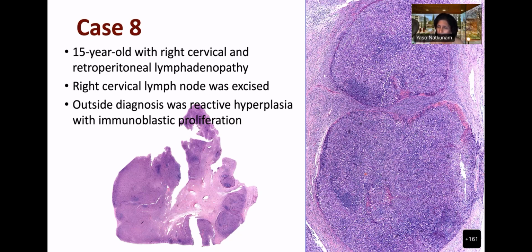It seems to me to have a mixed architecture, with one part of the lymph node showing complete effacement of the architecture on the left half, and the other half showing a follicular nodular pattern, with the two nodules, follicles, you have focused on at higher power. In the nodules there are some darker stained areas that seem to be part of a remnant follicle left behind, that you pointed to with the laser, and some other areas which have totally been replaced. Because of the more pinkish staining in the tumor mass, they probably have some cytoplasm. So I'm tilting towards a large cell type malignancy.